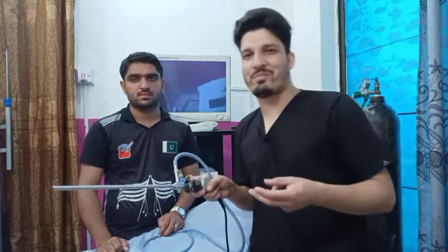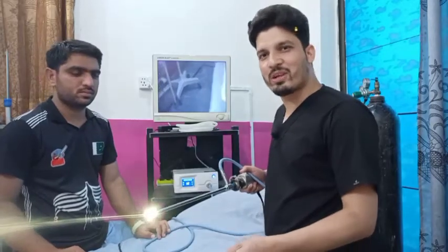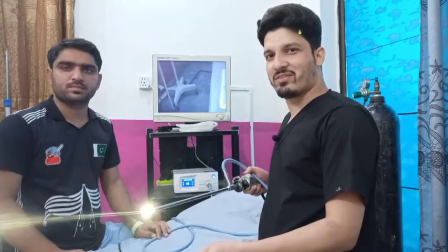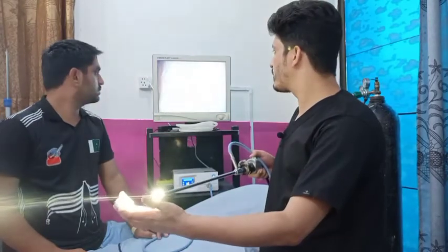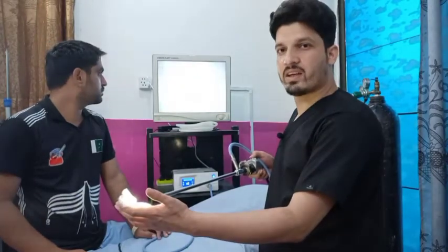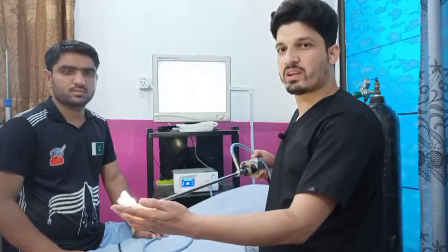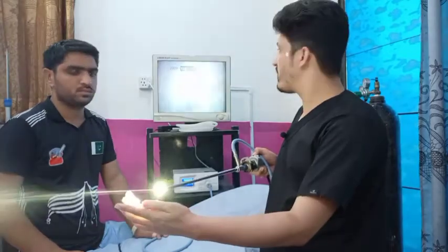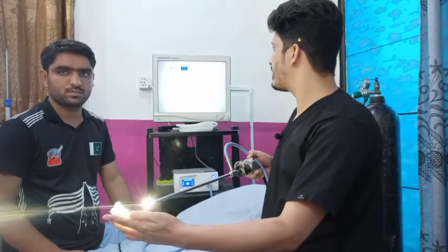I am going to demonstrate the basic setting — that's the white balancing of the camera system. For that purpose you will have a white object in front of the camera so that the whole screen is covered with the white object. After that you will press the W button on your camera head.